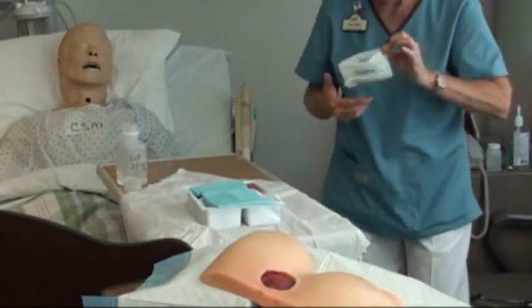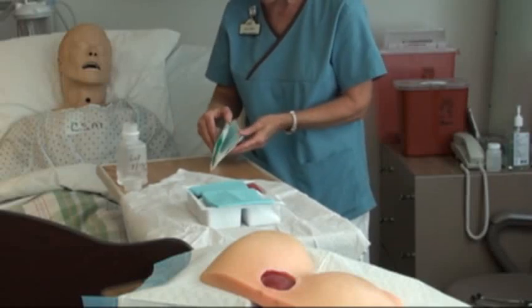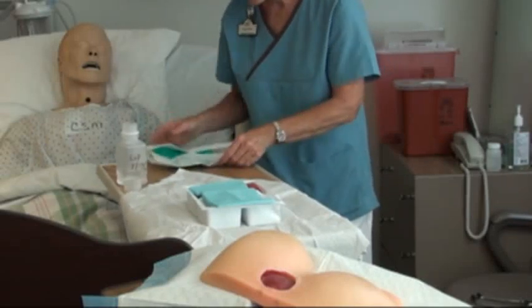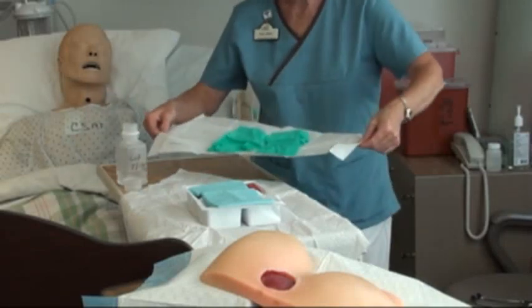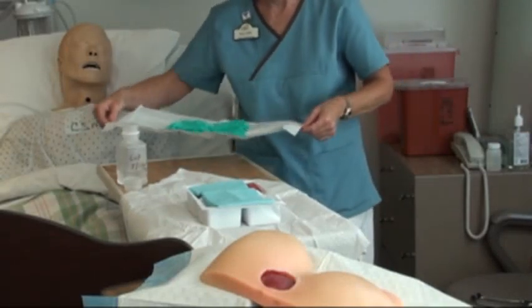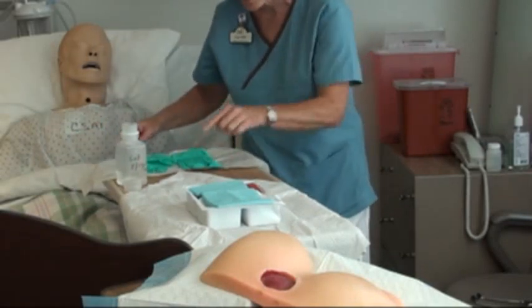Reach in and take them out. This is why I want this part of the table clear — what I'm going to do is open my gloves here, across the side. If I open them on top of the sterile field, I just contaminated it. So open them here where you can actually get to them, and you still have the one-inch margin.